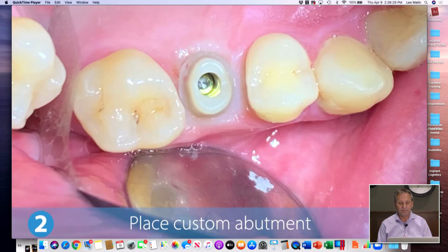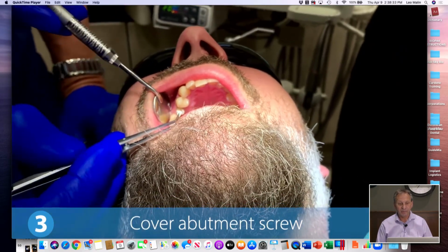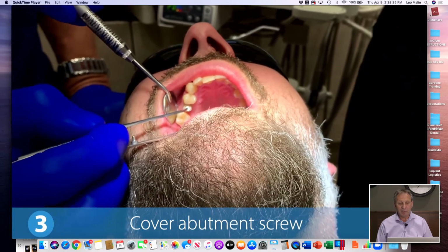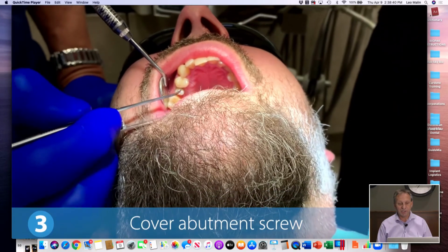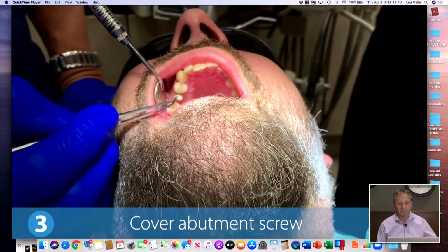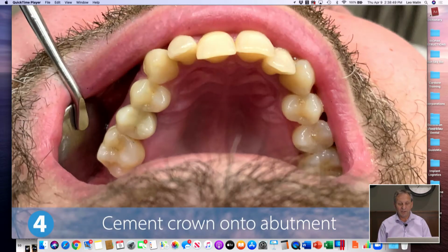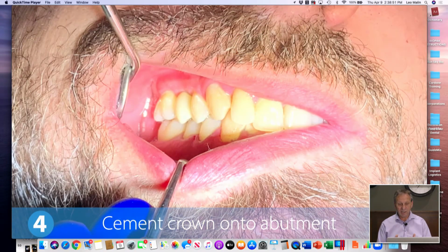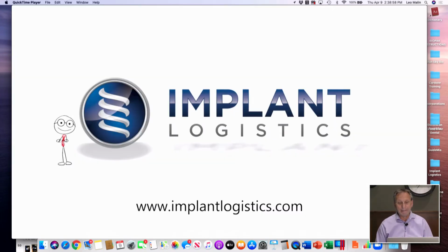Abutment and crown will go in place. Torque it down to the proper torque, depending on which implant system you're using. I use basically plumber's tape to cover up the screw. So whatever you guys use, I'm sure is just as good, but that seems to work well for me. And then cement the final crown. So that's basically the whole process from start to finish. Could be done in as few as 3 appointments in your final restoration. Final placement position with x-rays verifying that everything is fully seated.